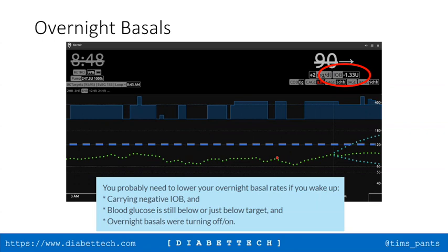No, I don't think there's been any bolusing in that example in the recent past. So I would call that a basal issue rather than a duration of insulin action, unless this person had something to eat at midnight and bolused for it. Yes, exactly. That's the point. In this case, it's the basal because there was no positive insulin in the past.